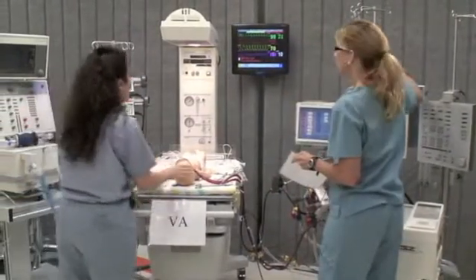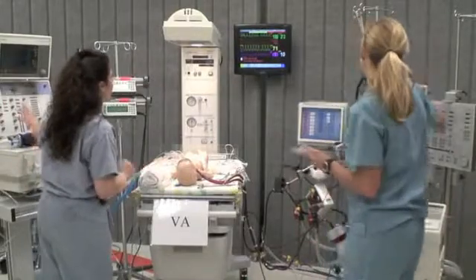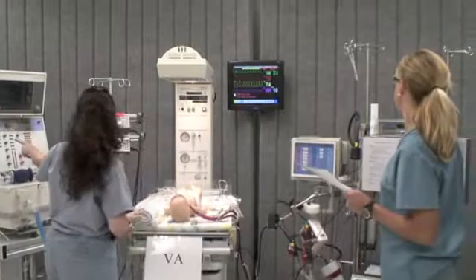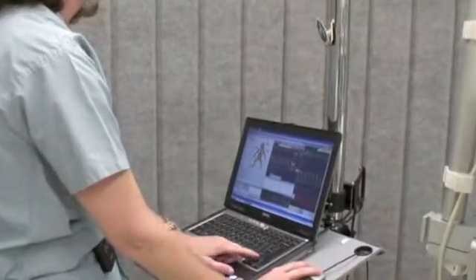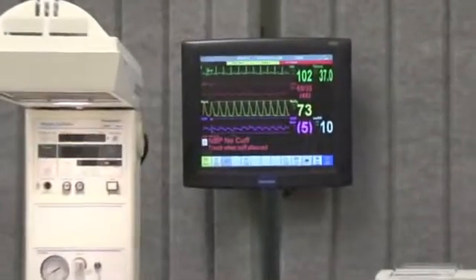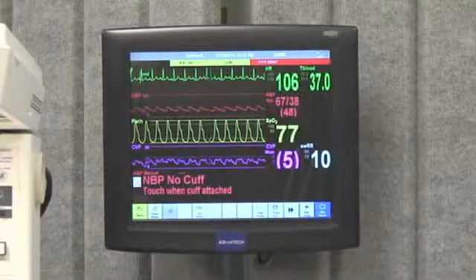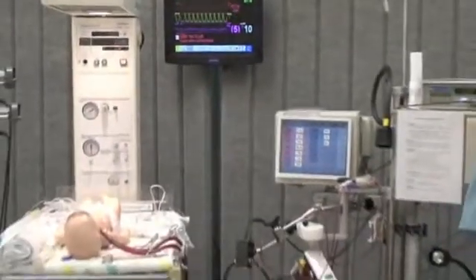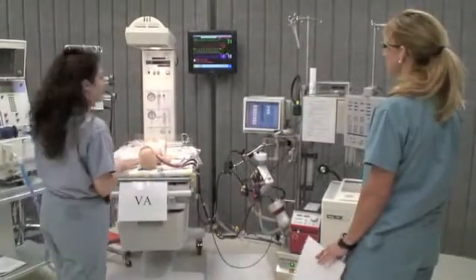Is my patient getting better now? Not yet — a little bit here. We're still at 100% on the vent and on the emergency vent settings. It looks like our vent's working. We can turn down the FiO2 a little bit. Our patient's not getting better very fast. I'm going to go back up on the FiO2 to my membrane a little bit. It looks like we're getting some response.